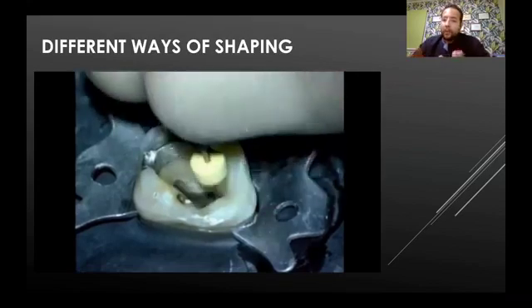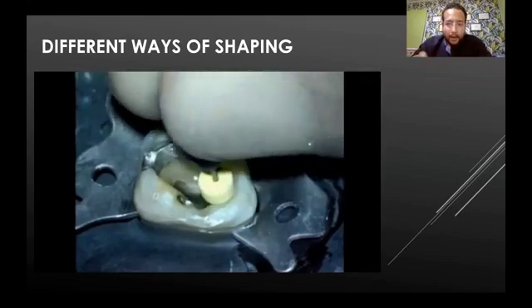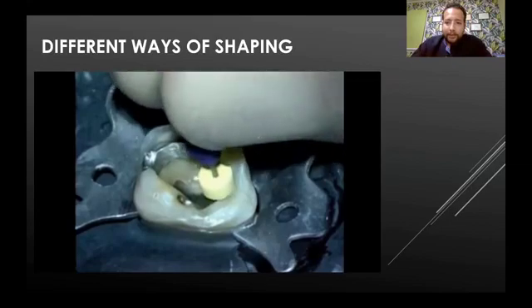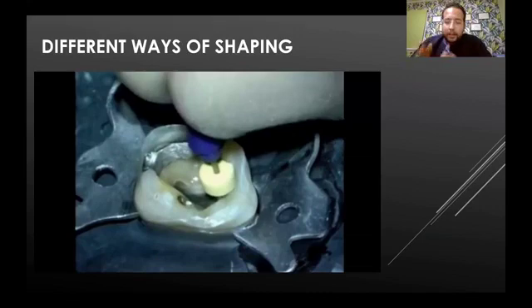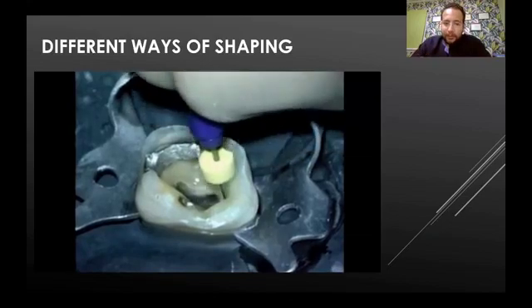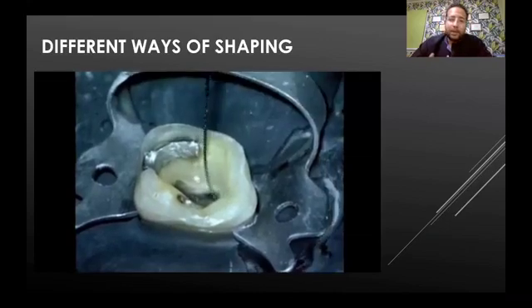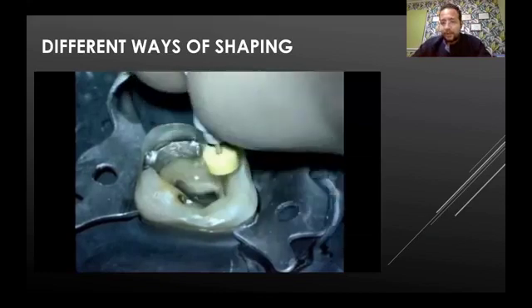Then he does patency. What is patency? It's half to 1 millimeter short strokes beyond working length. Okay, so recapitulation is long strokes along the working length. Patency is short strokes, half to 1 millimeter beyond the working length. Okay, that's how the shaping is done. And then you move to the other file, or to the same file in case of resistance.